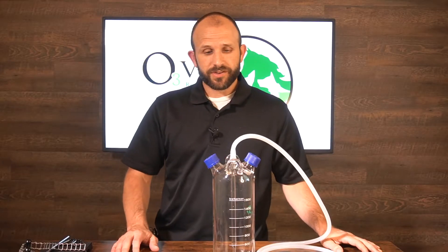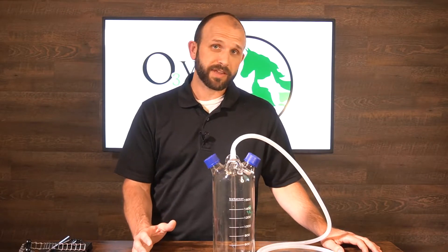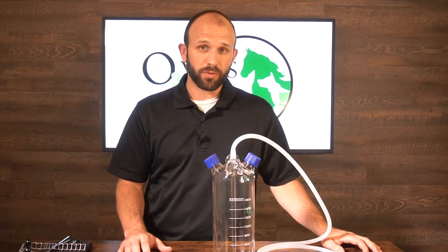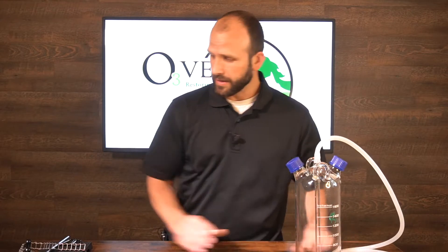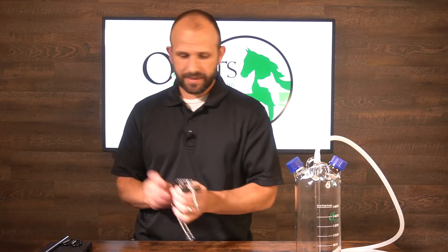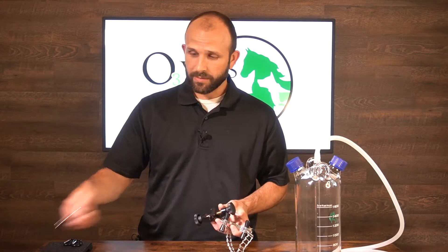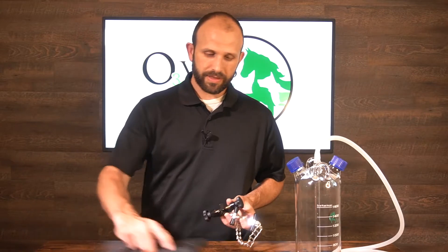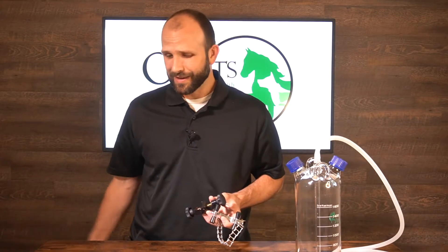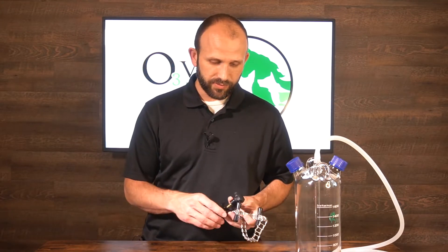Next we're going to show you how to attach this bubbler to either the tabletop stand or to the IV pole. We're going to start with the tabletop stand. You're going to get a chain clamp, a boss clamp, a steel rod, and a really heavy iron plate. Those are the different components you'll be using.